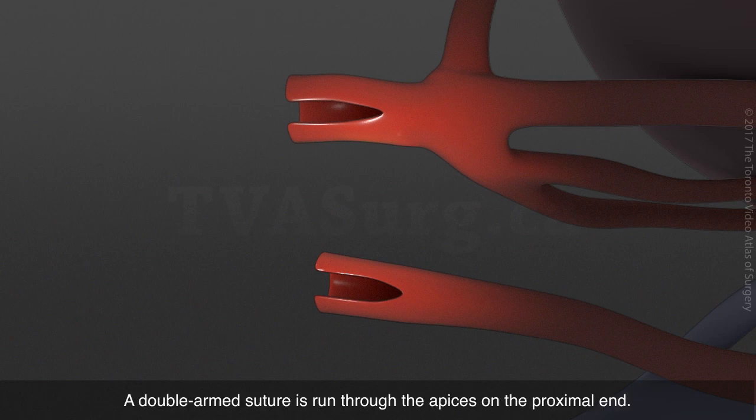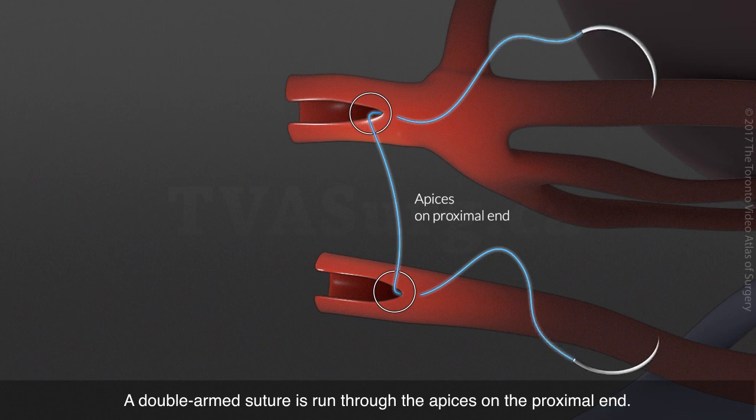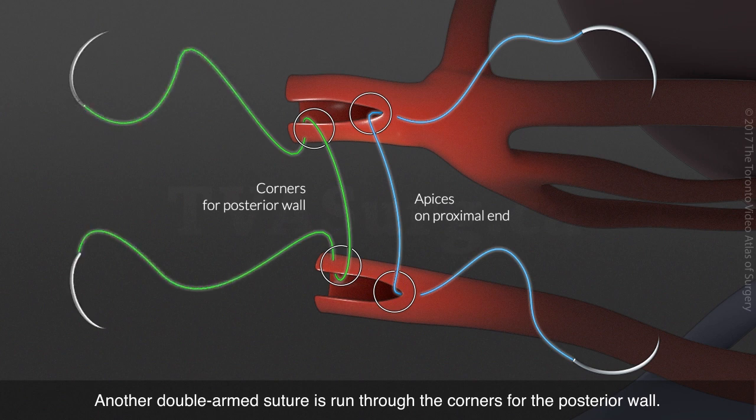A double-armed suture is run through the apices on the proximal end. Another double-armed suture is run through the corners for the posterior wall. These form the stay sutures.